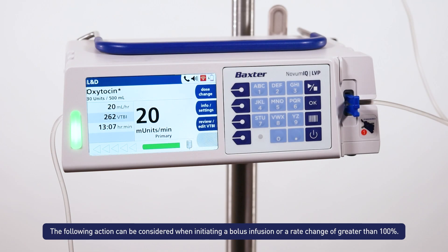The following action can be considered when initiating a bolus infusion or a rate change of greater than 100%.